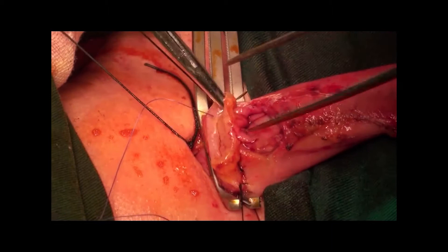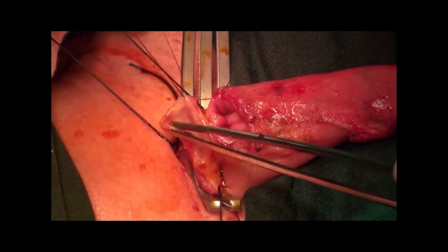A 4-0 suture was used to create the mucosal anastomosis. A purse-string suture was adopted at each of the ends.